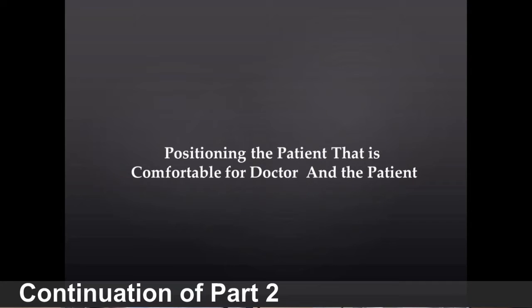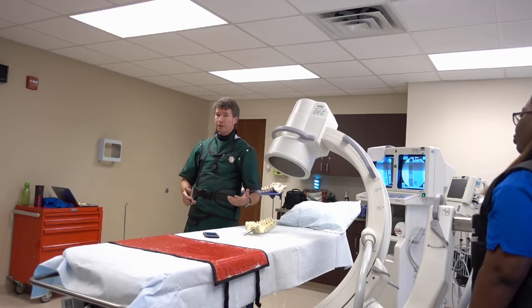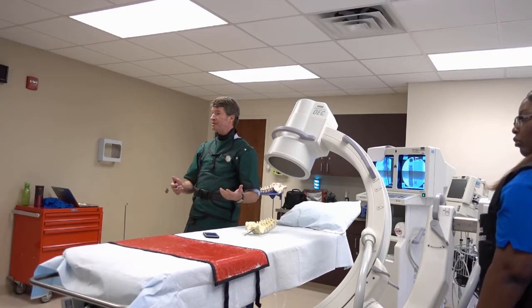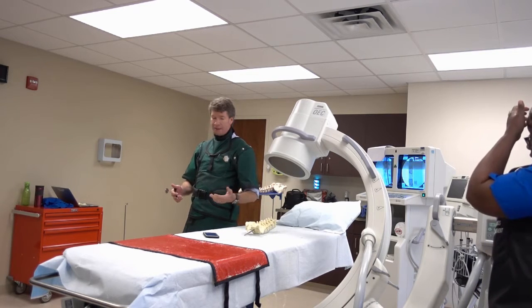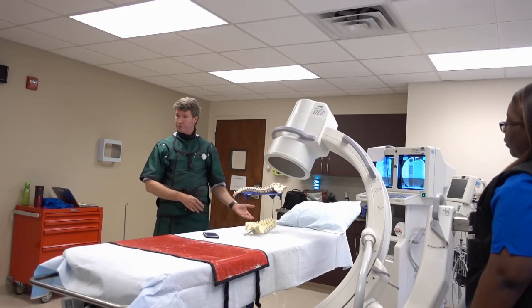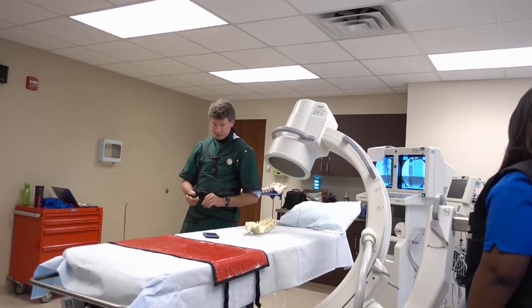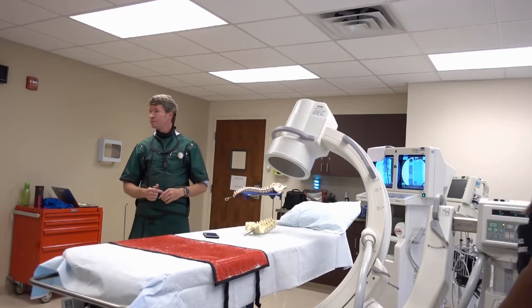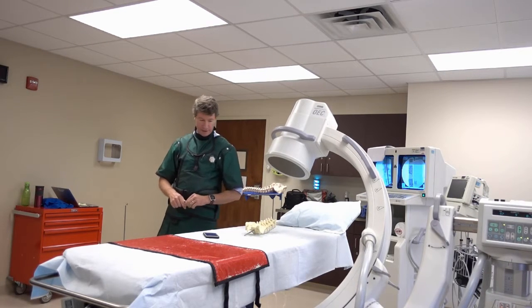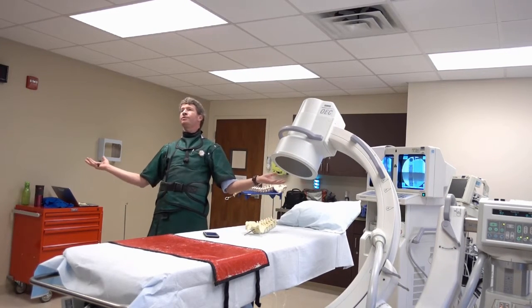So let's talk about patient positioning just a little bit. We position the patient to provide the easiest access to the anatomy. And in most of our procedures, the patient's lying face down. What do we call that? Anyone? Prone. What's the opposite if they're looking up? Supine. Exactly. So prone is looking down. I was thinking supine, they're just hanging out holding some soup.